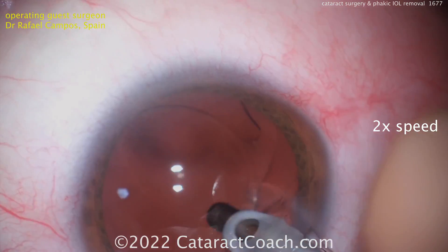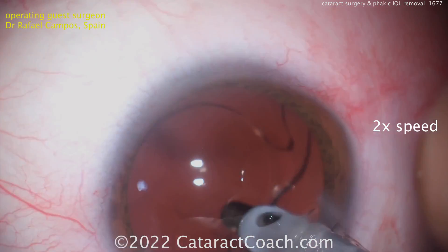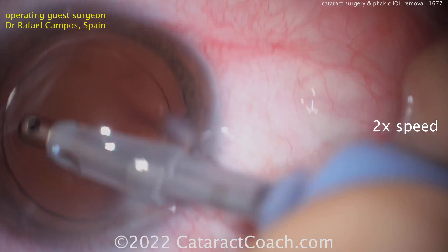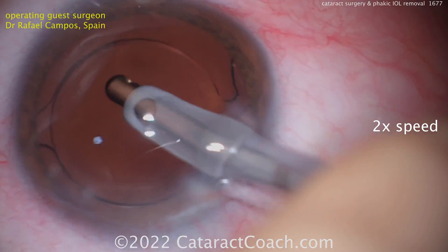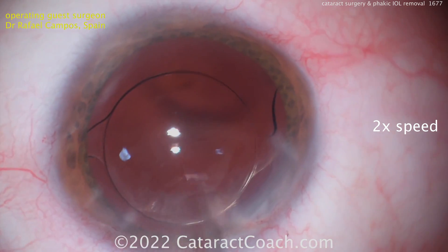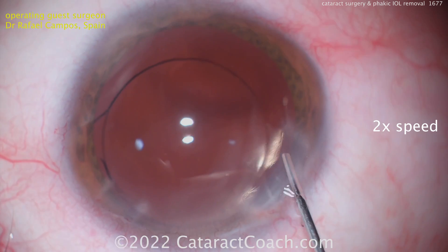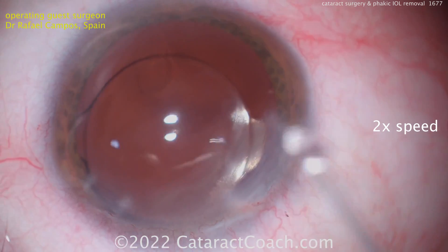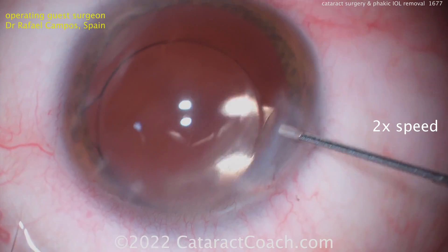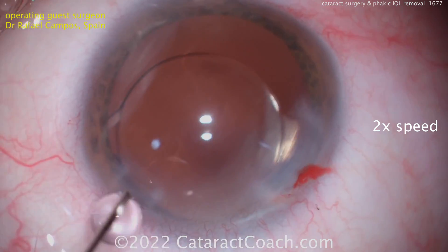Be careful in these eyes, especially young males who have cataract surgery when they don't have a PVD yet — a posterior vitreous detachment — because they may be at high risk for retinal detachment. For patients like this, I actually like them to see a retina specialist before the cataract surgery, and then a month or so after, they need to see the retina specialist again. You're replacing that thick human lens with a thin IOL, the vitreous shifts, and there can be traction on the retinal periphery. If there's a weak spot, it could result in a break — better safe than sorry.